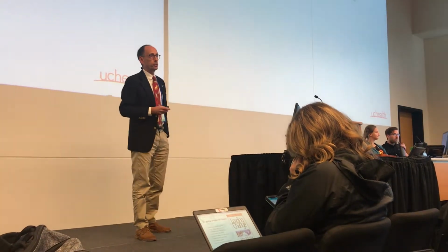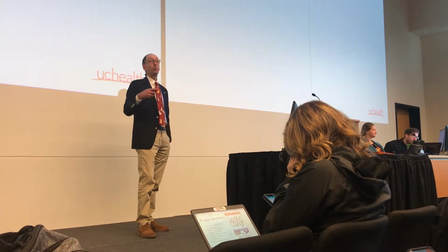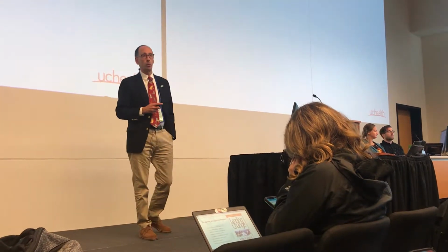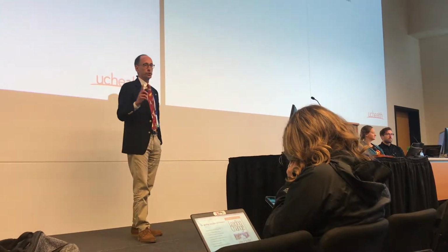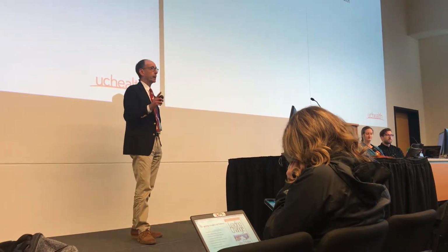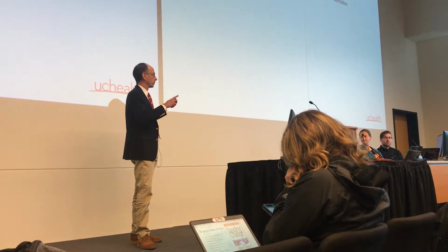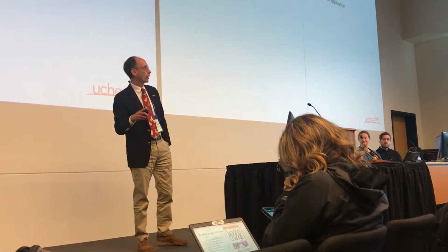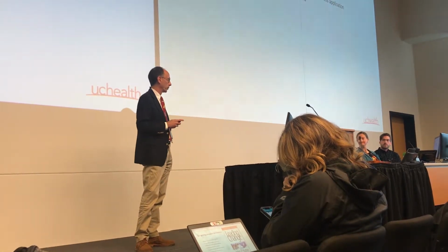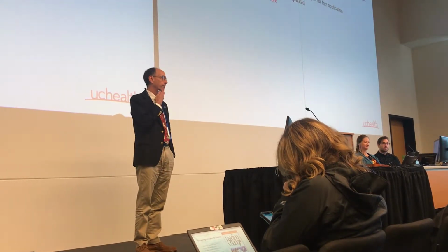So we used the Subi link, the standard URL-based integration link, which is in MyChart. We put it in MyChart, and it's identical to what's on the image tab in the Epic chart. Just to note, this is not the same as Epic's JPEG imaging viewing tool. This is a DICOM Viewer. Sean Bina, of course, 5 seconds before the talk, tells me that Share Everywhere has embedded viewing as well. And I'm sure they'll be sharing more with you about that.